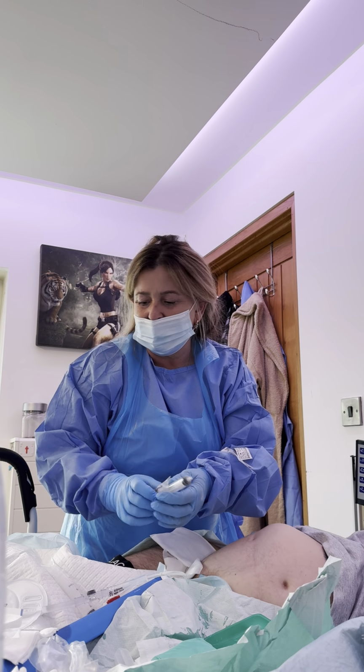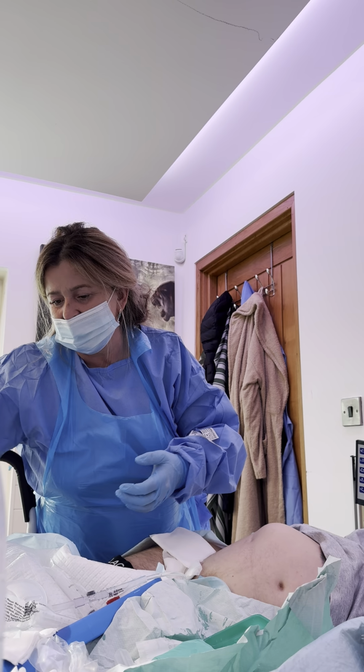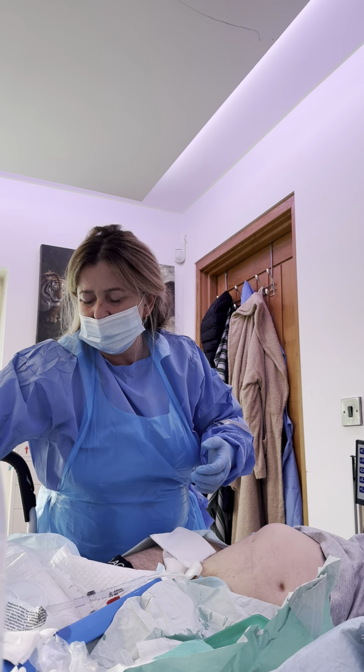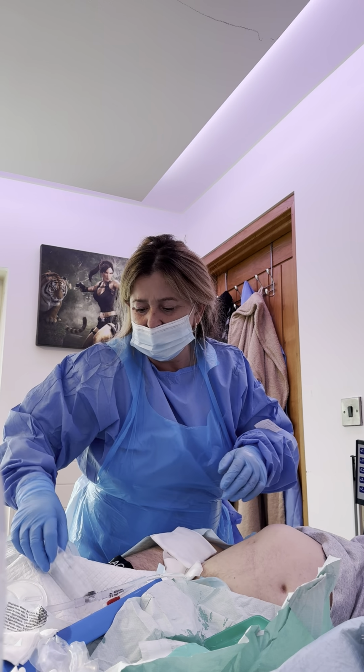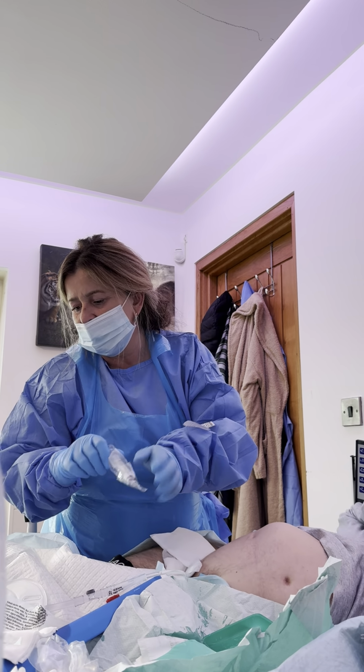So all I'm going to do is get the old one up. The old one's here. It's disgusting. Absolutely disgusting. And then I'll just deglove it. It's one of the actual worst ones I've seen, if you want the truth from me.